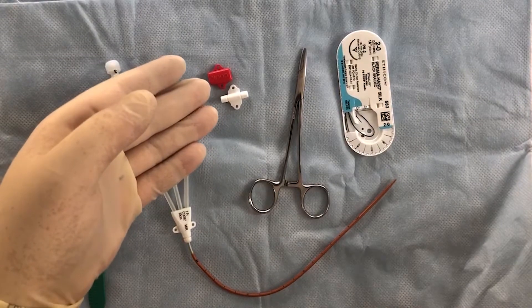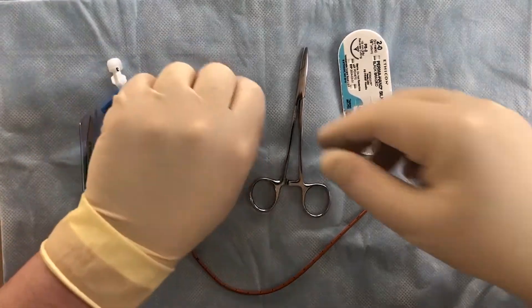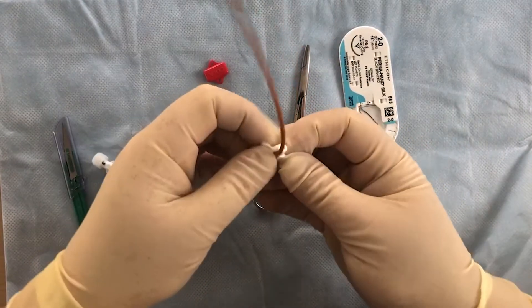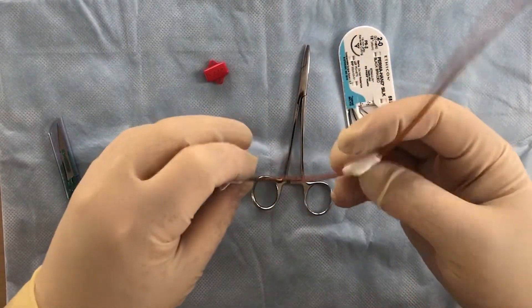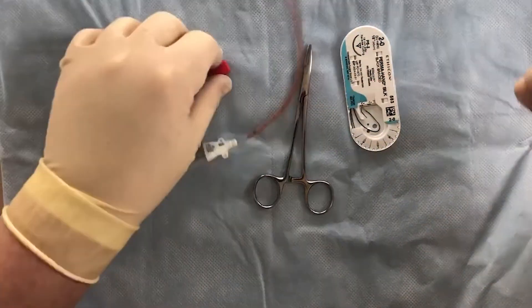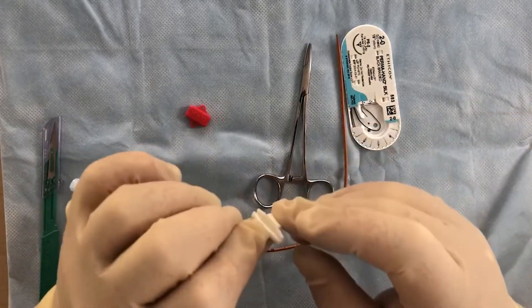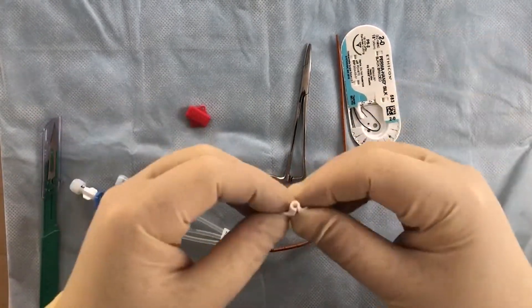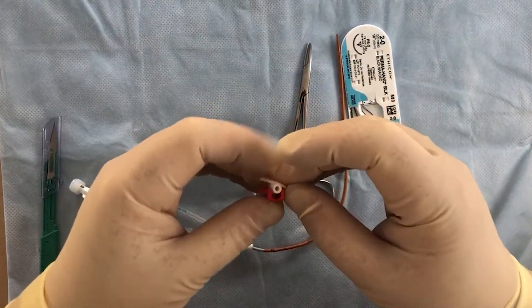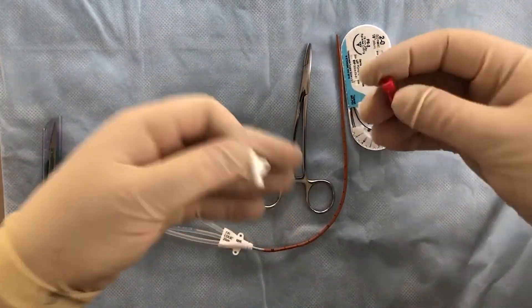This little device here has actually probably been the culprit. These are two pieces of the same device — this little piece has a split in it that's meant to place the catheter in. The problem is that people have been placing the 20cm catheter, and it can slide, especially if it gets wet, which it almost always does because this procedure involves some bleeding since you're piercing the skin and the vein. So this, though it purports to be a securing device, is more of a base that allows you to place the 20cm on the right, which you should not do.